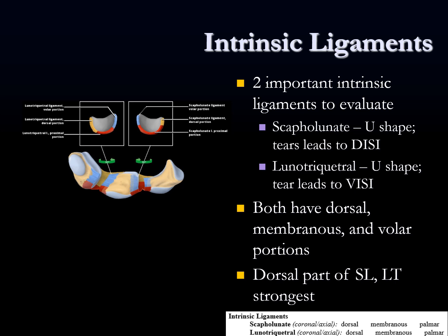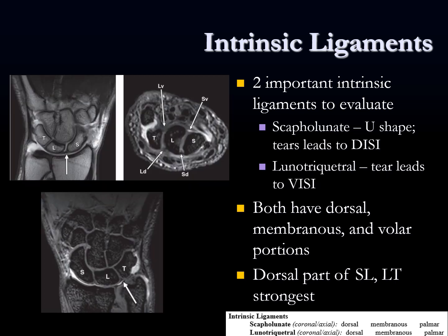They're both U-shaped ligaments having a dorsal, a membranous, and a volar portion. The dorsal components of both ligaments are the strongest — the most important stabilizers of the intrinsic ligaments of the wrist. We evaluate all three components and comment on them. When looking at the intrinsic ligaments, try to visualize each portion on both the coronal and axial images. Here are some MRI images showing those bones in the proximal wrist — scaphoid, lunate, triquetrum on the coronals — with notations of how those ligaments look on the axial images.